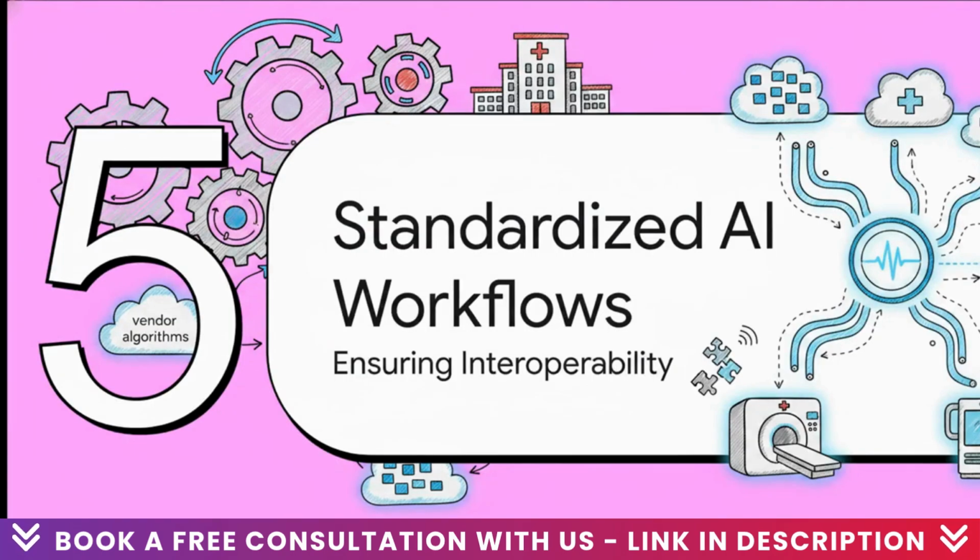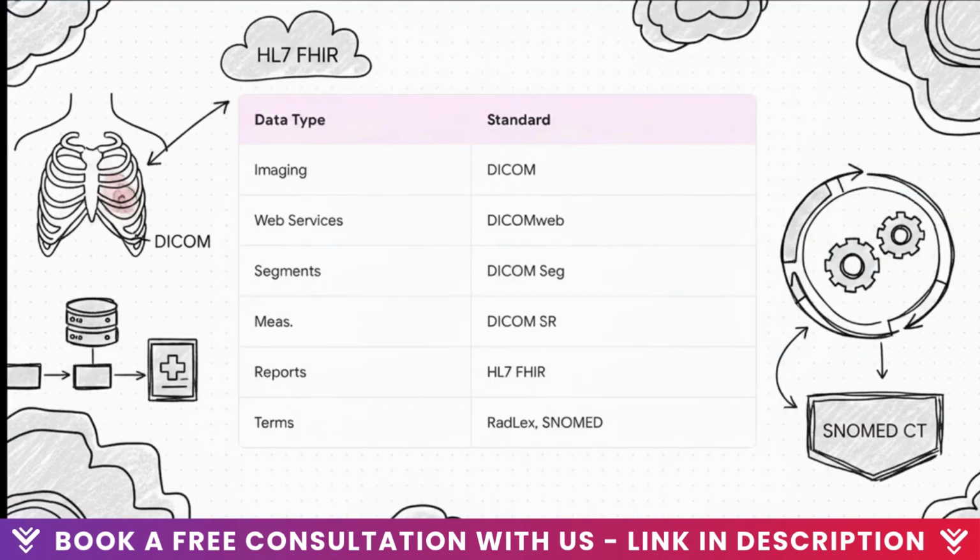Section 5, standardizing AI workflows. To ensure this AI orchestration actually plays nice across different vendor algorithms and hospital systems, your architecture has to rely on strict interoperability standards. This requires a rigorously mapped, standardized ecosystem. Interoperability isn't just a fancy IT feature anymore. It's a hard clinical requirement.